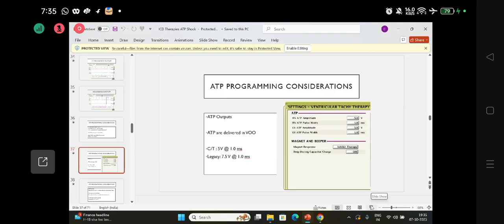Remember this. If you are doing secondary prophylaxis, the patient had a VT, don't go for low zones only because the patient says, I get very disturbed. Let him get disturbed. Not important. Remember, till 15 joules, there is aggravation of pain. From 15 to 40 joules, the maximum joules available in today's ICDs is 40, it's all the same pain. If you are doing it for primary prevention, you can keep 10.